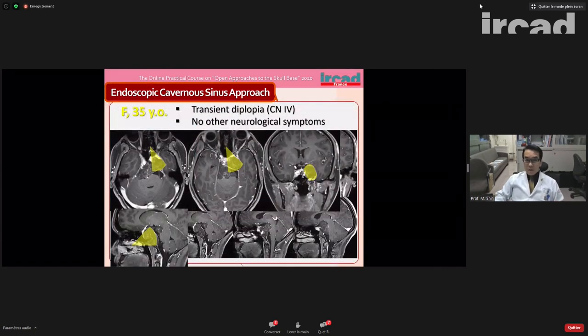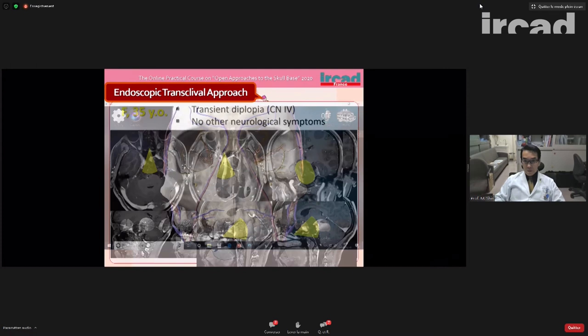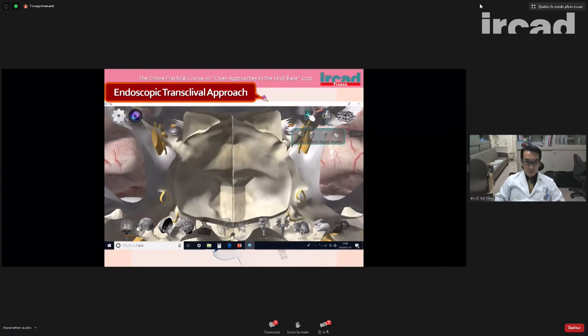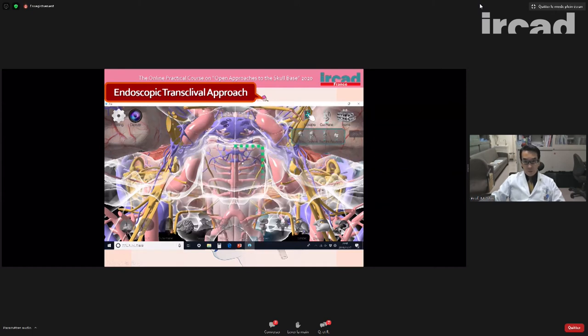So in this case, I think for the cavernous part, maybe this is a virgin case, so maybe the tumor can be easily dissected from the cranial nerve. So we should attempt the transcavernous approach. And then for the clival part, we should try the transclival approach. The clival recess is located in between the carotid prominence and below the sellar floor. So we open this part here.